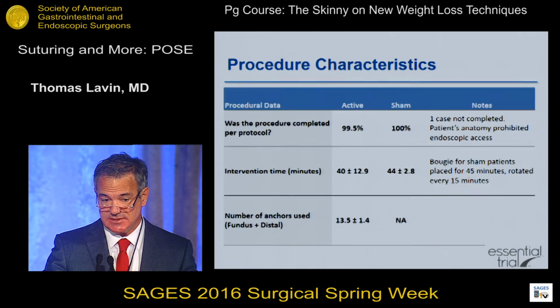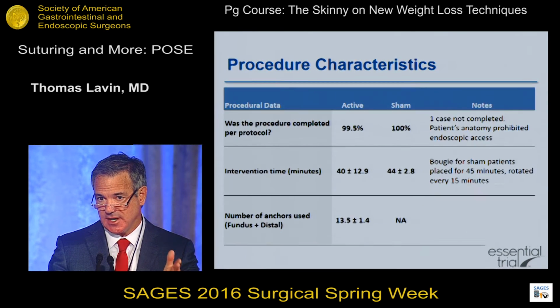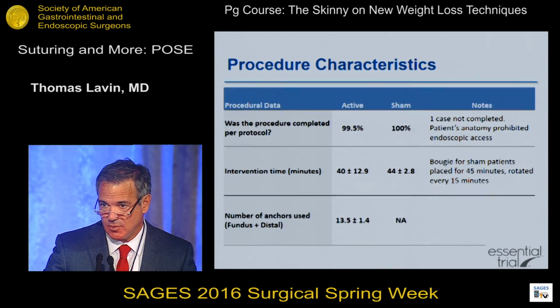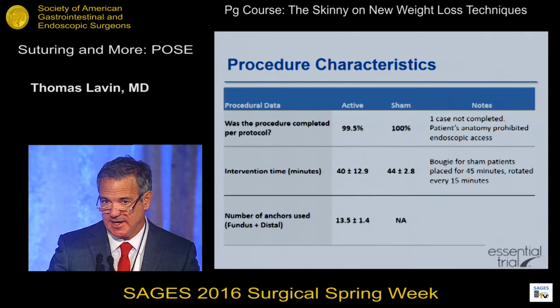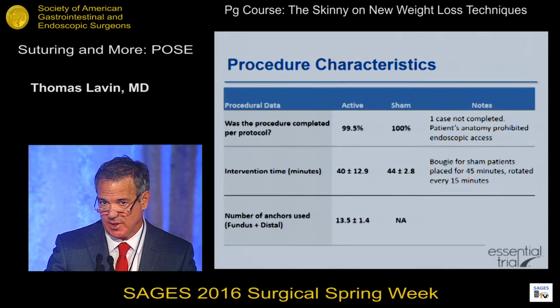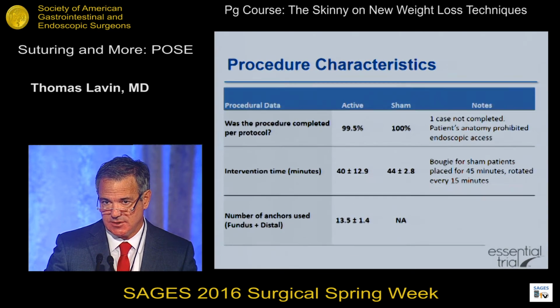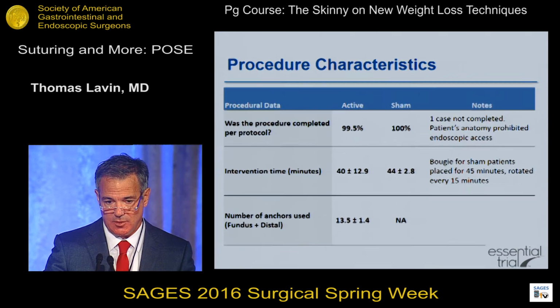It was designed such that if you were in the sham arm, you stayed in the room for 45 minutes. That's why the sham arm cases took 44 minutes. And basically all we would do is a pre-op endoscopy under general anesthesia, and then place a bougie, and every 15 minutes just turn the bougie and wait in the room, and then of course go out and take all the precautions with the family so they didn't know, and the operative dictation was under lock and key, so nobody would know.